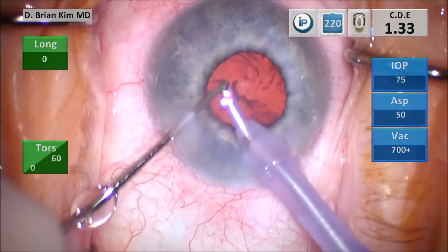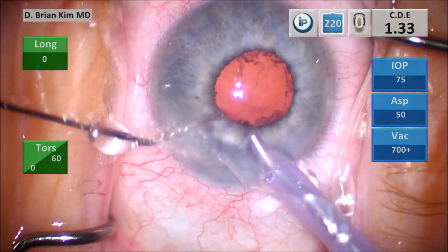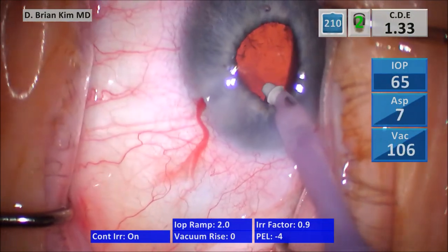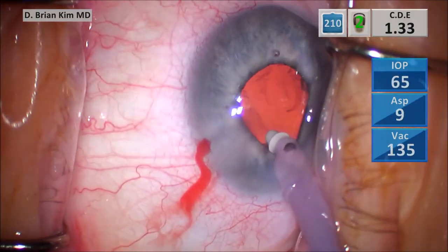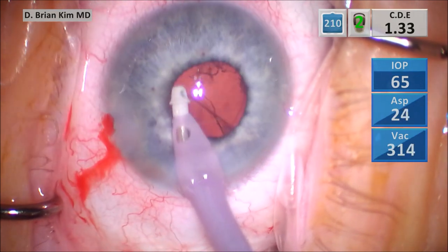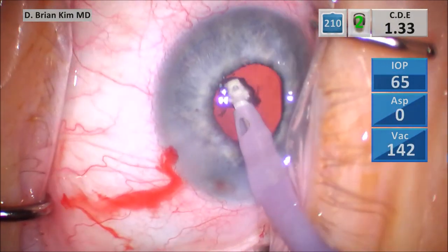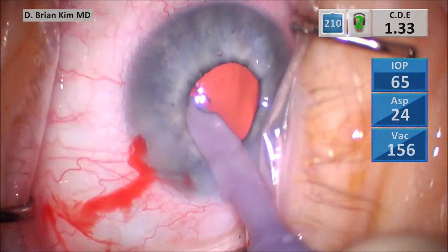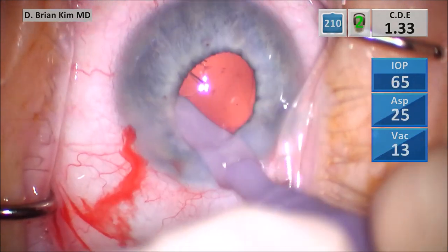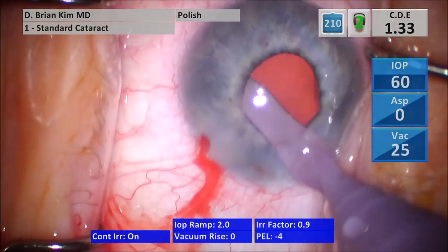I pull the iris back and I'm able to get that last piece of epinucleus. I then push BSS into the anterior chamber, and as I pull the phaco tip out I gently remove it, making sure the iris wasn't going to come with it. I switch to the IA handpiece, pushing BSS with the cannula to maintain some chamber stability. I start with the sub-incisional iris, but you can see the iris wants to come to the tip. I'm able to find the sub-incisional cortical material and sweep it out — this is all about positioning. I go right up to the cortical material very gently, avoiding the iris, grabbing the cortex from the anterior side and peeling it out. Because visibility is poor, you don't want to use high vacuum until you know you have the cortical piece in hand — activate with a little bit of vacuum first, then once you engage the cortex you can go with high vacuum.